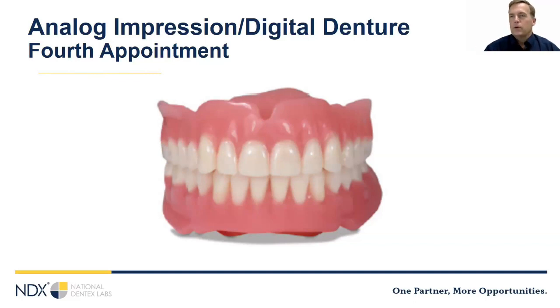So do talk to your laboratory about the workflows that they use so that you guys can pick something that'll get you both the great results that you want. Once you get that final denture, you'll check the fit and bite, and sometimes it's nice to put some cotton rolls in there and have the person bite down for about 5 minutes just to help stabilize it.